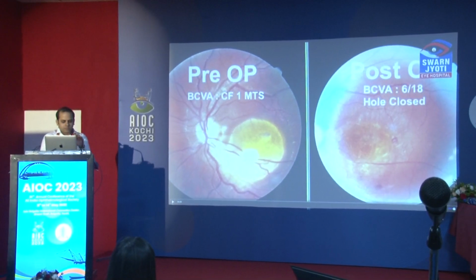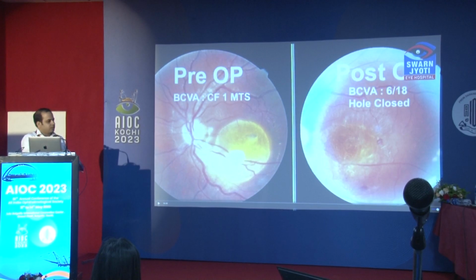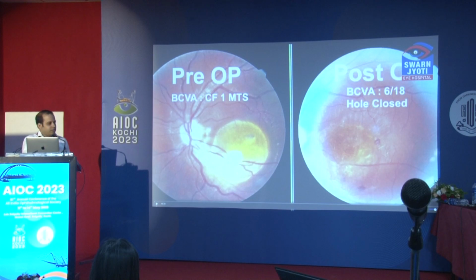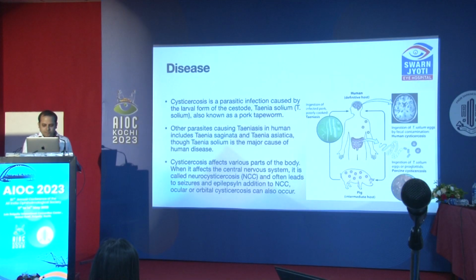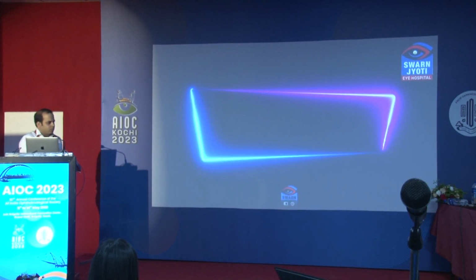So the retinotomy, I felt, was on the bigger side, so I thought it would be prudent to laser it. And I felt that the macula looked quite fragile, so an ILM peeling or something of that sort would have been very difficult in this situation. But the hole closed well post surgery, and it was not due to any tangential traction or anything. So I think we would get results without ILM peeling. Dr. Bhavik, your take on this?